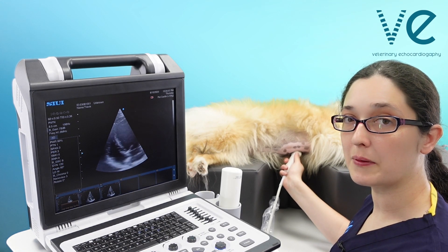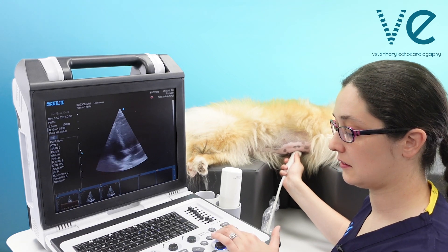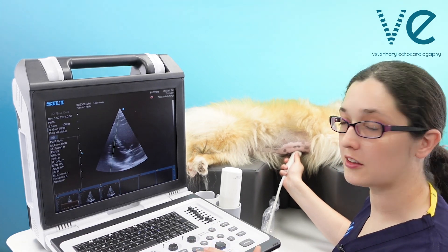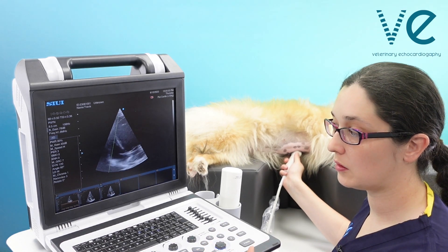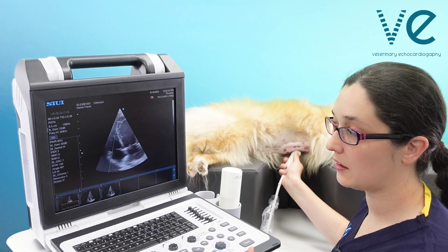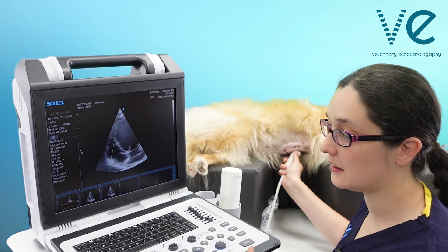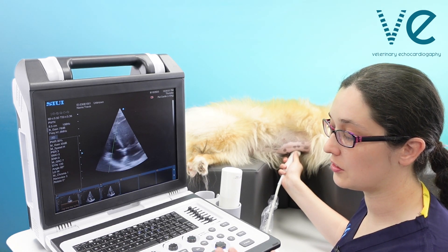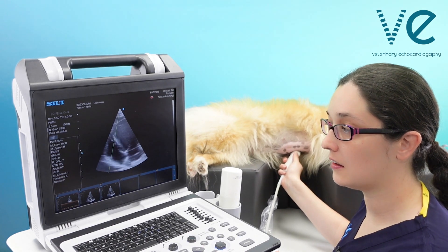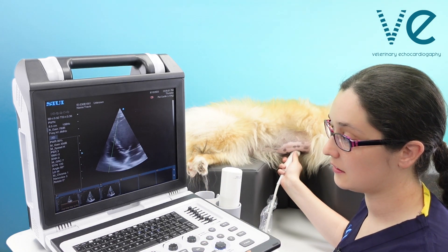To take my TAPSE measurement, activate M-mode, make sure my M-mode line goes through the Tricuspid Annulus, and the right ventricle is contracting longitudinally along my line.